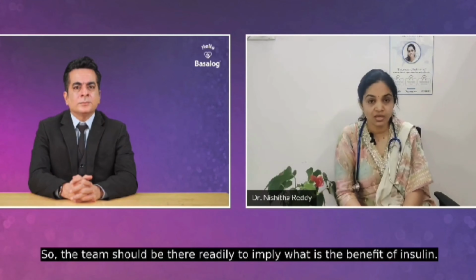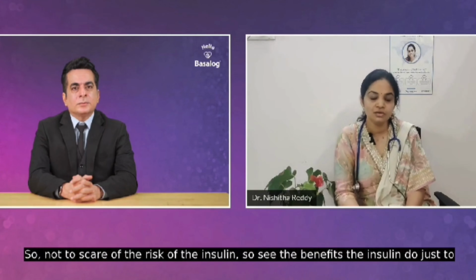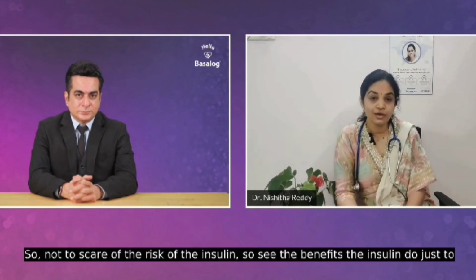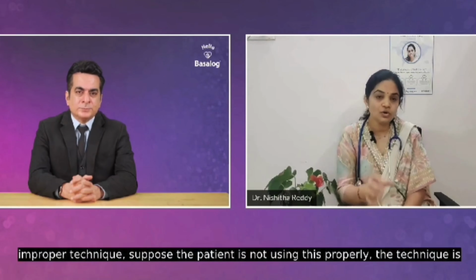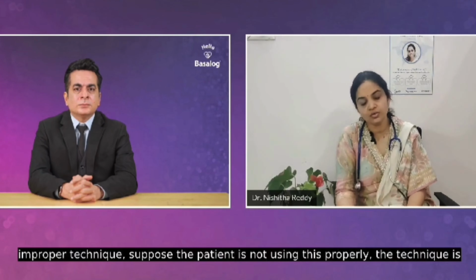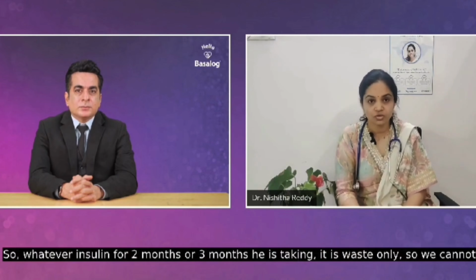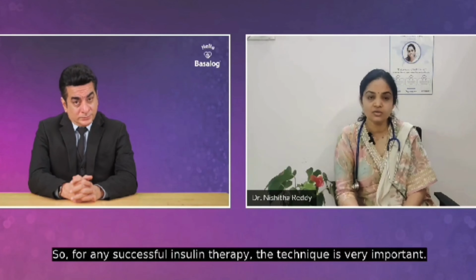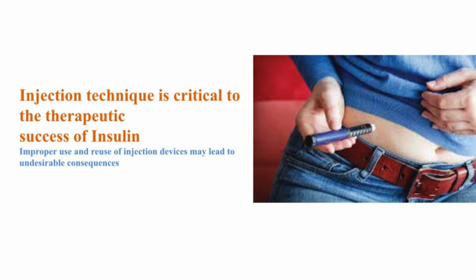The team should be readily available to explain the benefit of insulin, so the patient is not scared of the risks of insulin. Then injection technique. If the patient is not using the pen properly and the technique is wrong, then whatever insulin he is taking for 2 or 3 months is a waste, and we can't achieve the target. For any successful insulin therapy, the technique is very important.